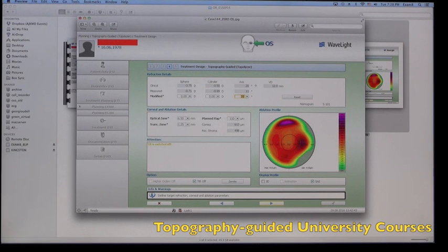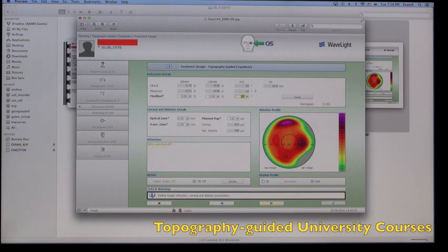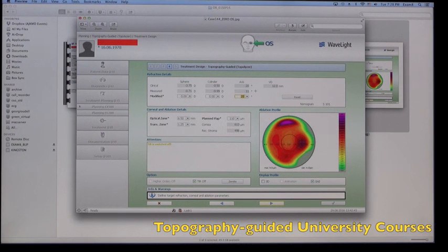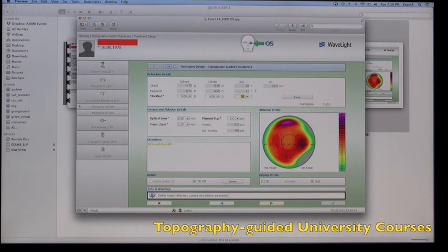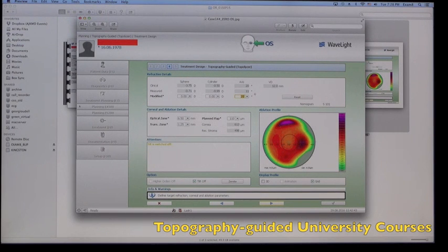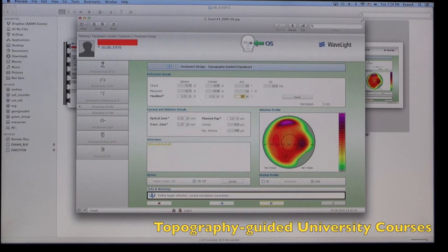Then on the middle row, there is a measured refraction which is what the topographer suggests as a refraction. Of course, the sphere is really elusive because the topographer does not have any axial length data. So here we're paying attention to the amount and axis of cylinder.